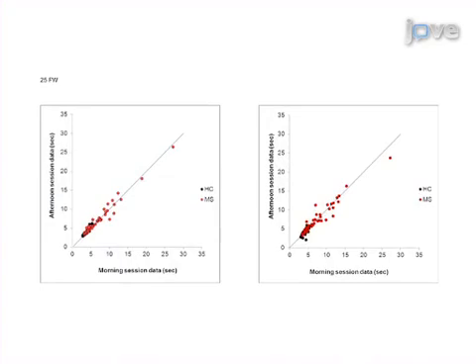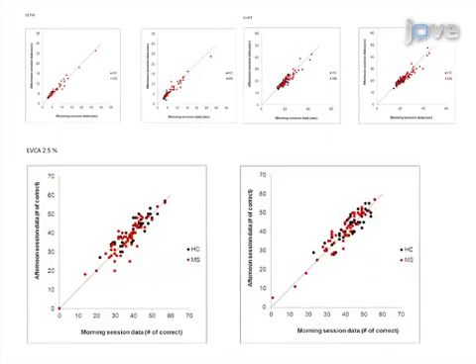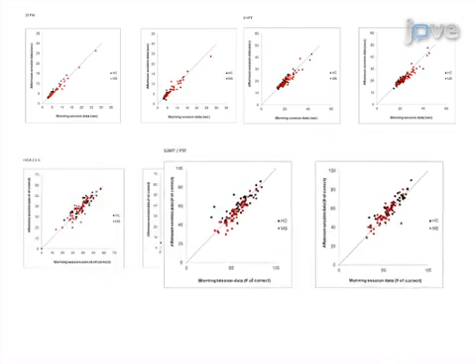Ultimately, neurological and neuropsychological performance is quantified and compared with reference populations to determine type and severity of disability in each particular subject and to compare change over time.